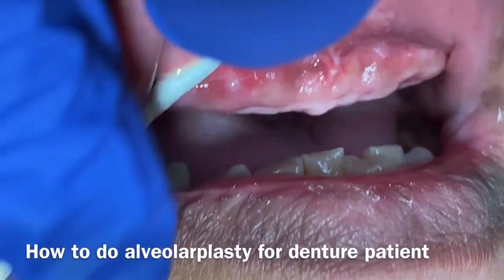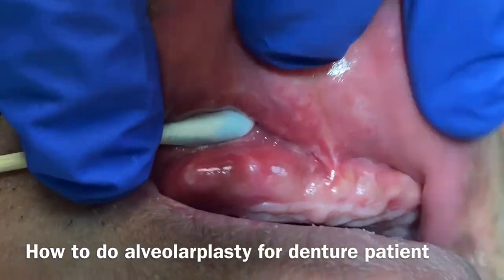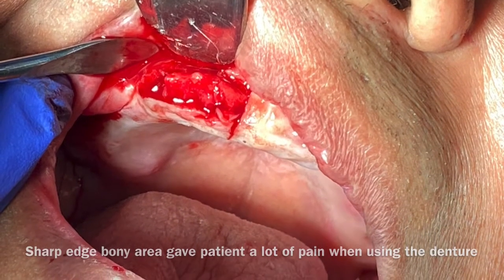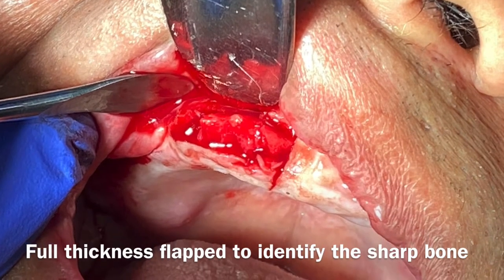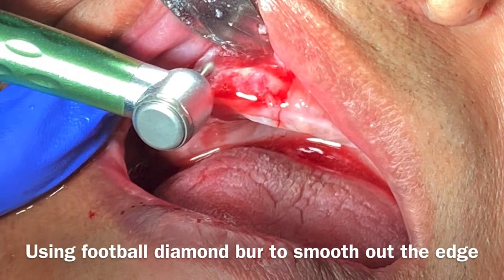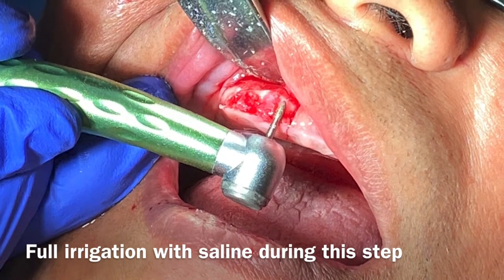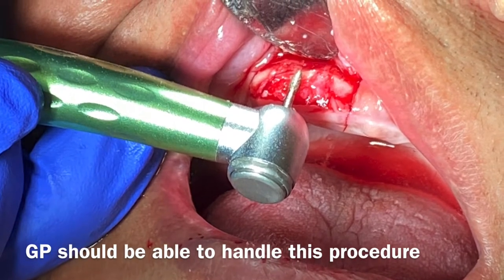Have you ever had a patient complain after a full mouth extraction for dentures about a spicy bone sticking out and hurting? This is a case where in the number seven and eight areas there's a lot of sharp bone. You raise a flap, use the bur to smooth it out, put the flap back, and you're done. It should be quick and easy — every general dentist should be able to do this for their patient instead of referring to an oral surgeon.